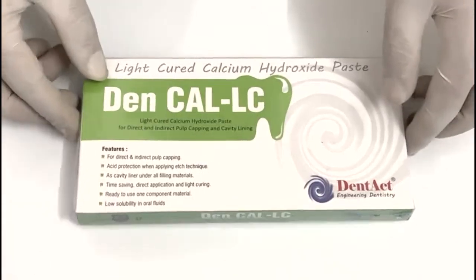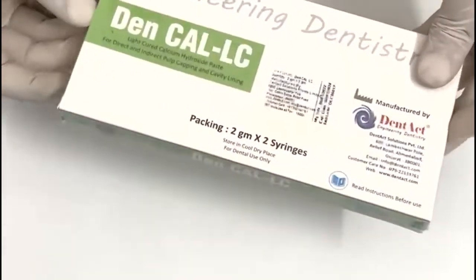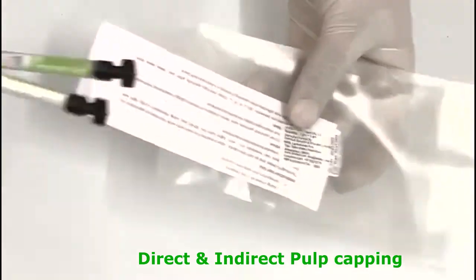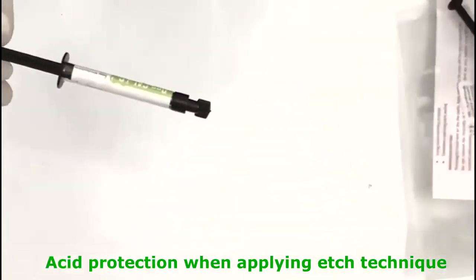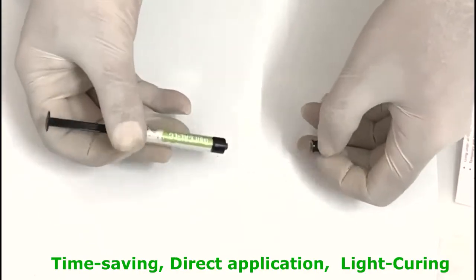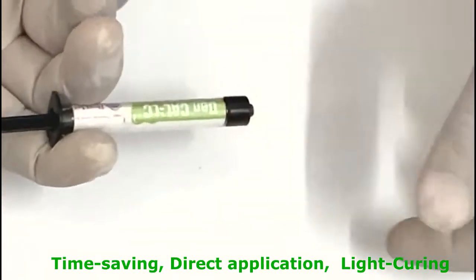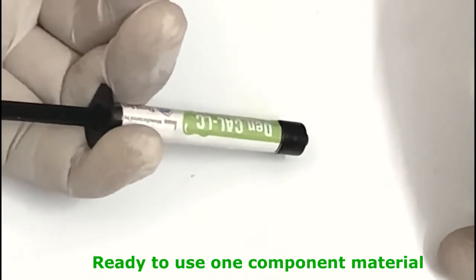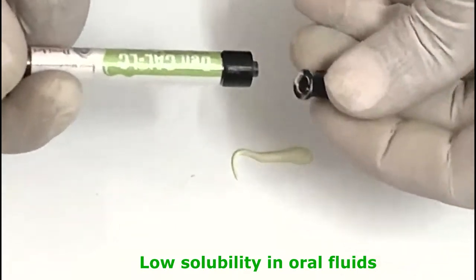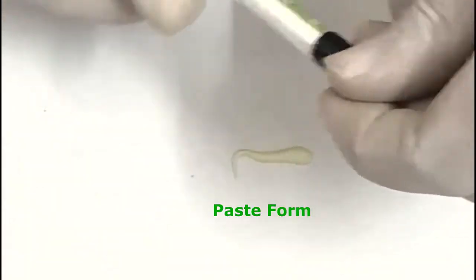Den CAL-LC is a light-cured, radio-opaque calcium hydroxide paste useful in pulp capping and as a protective base liner under dental filling materials, cement, and other base materials. Its features include direct and indirect pulp capping, acid protection when applying etch technique, use as a cavity liner under all filling materials, time-saving direct application, and light curing. It is a ready-to-use one-component material with low solubility in oral fluids, available in paste form.